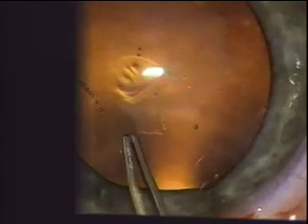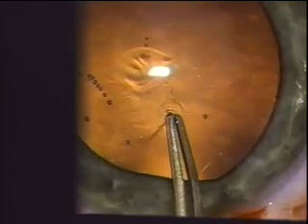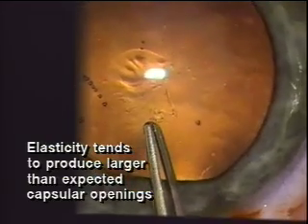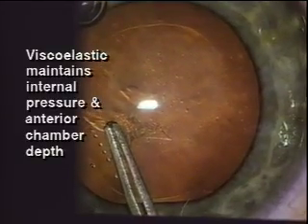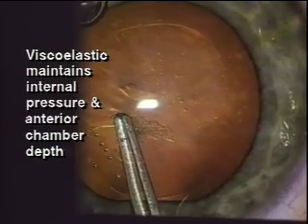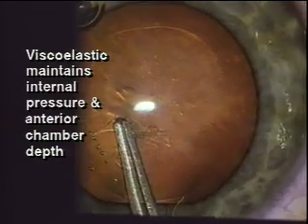The continuous curvilinear capsulorhexis of the anterior capsule is initiated with a cystotome and continued with the capsulorhexis forceps. The leading edge of the capsulorhexis should be directed to create an opening smaller than desired, because the elasticity of the child's lens capsule can often create a capsular opening larger than expected. During capsulorhexis, the internal pressure and anterior chamber depth is maintained by injecting a highly viscous viscoelastic agent such as Healon GV.